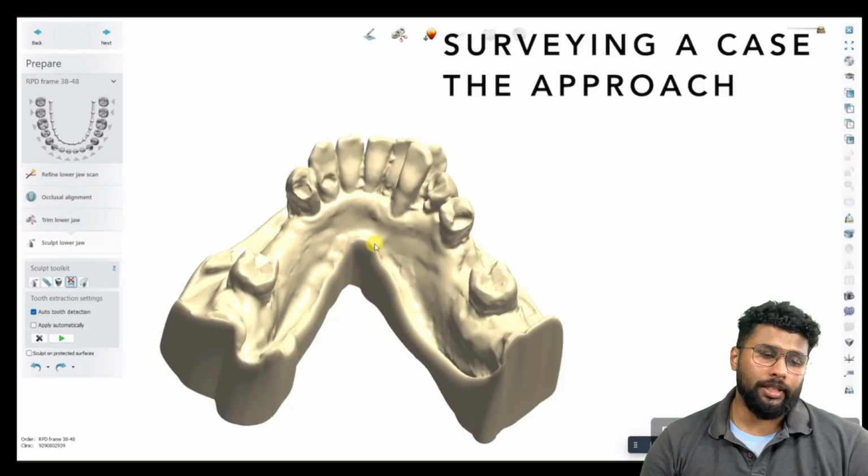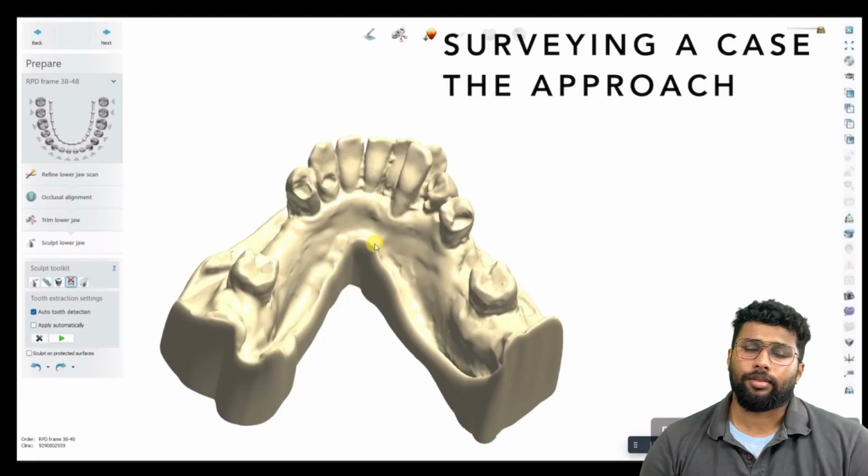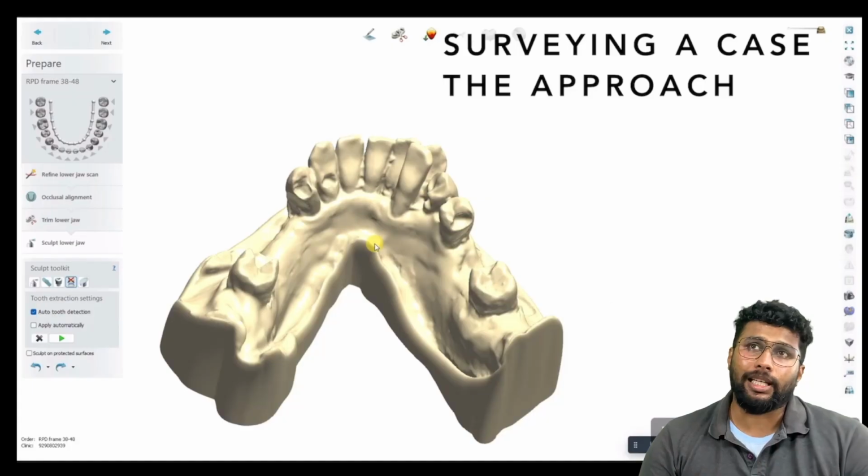One of the first things you notice is that there is a lingually placed lateral incisor there, which would either have to be plated or, in a better case scenario, be extracted so that we can go about our rehabilitative process.